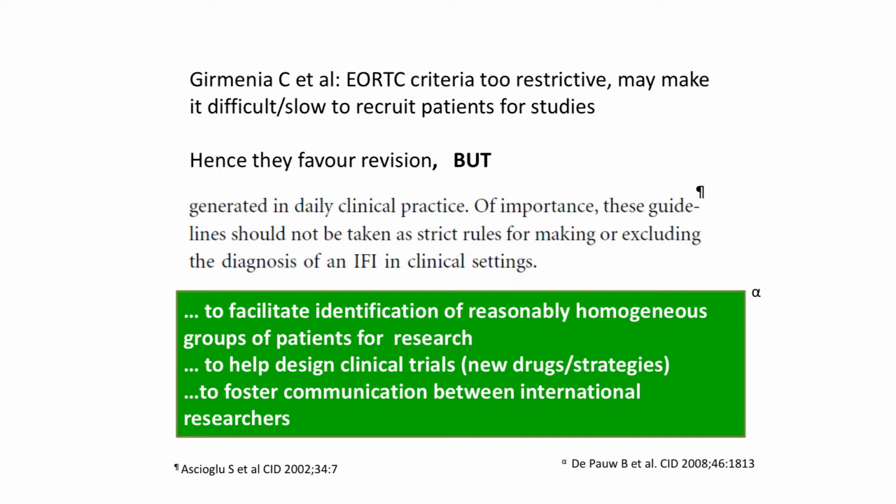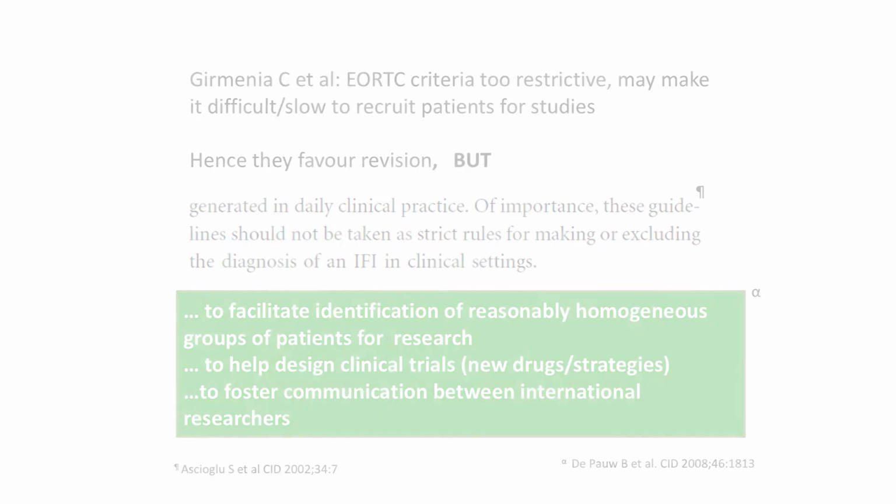So it is only by understanding that these signs evolve, that you may miss a halo, that the diagnosis may be clinched a bit later when the cavity appears, but it doesn't mean you must wait till the cavity appears, that you will understand that when you have an at-risk patient, it may be necessary to start ampho-B or nowadays voriconazole much earlier. Okay, since this is a talk about imaging and not just about halos, I thought I should go through some of the other signs that you could look for.